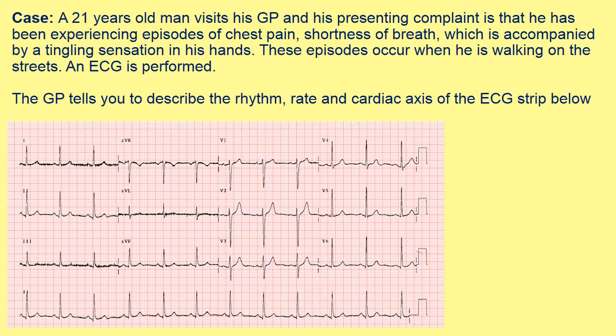So pause this video and have a read. When you finish doing it, you can continue playing the video.